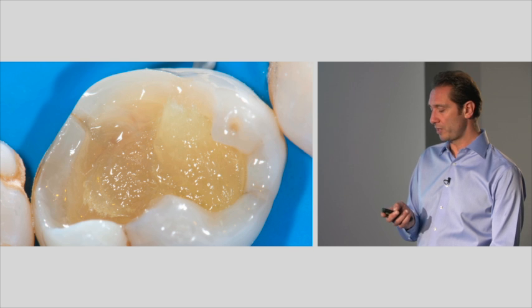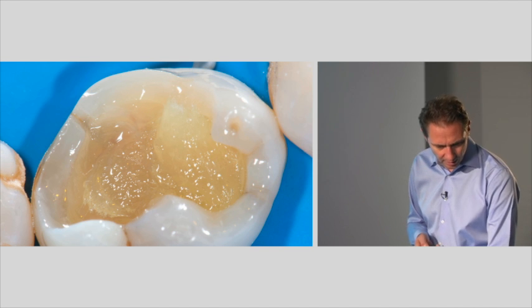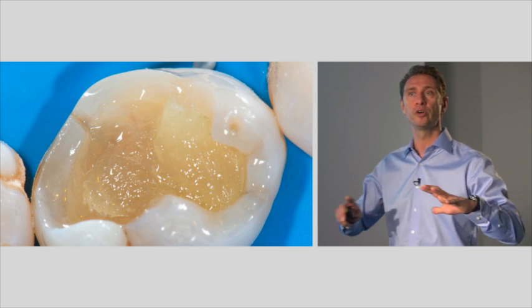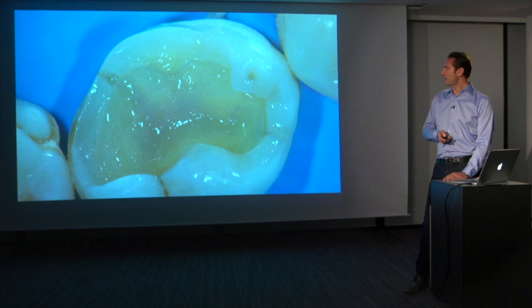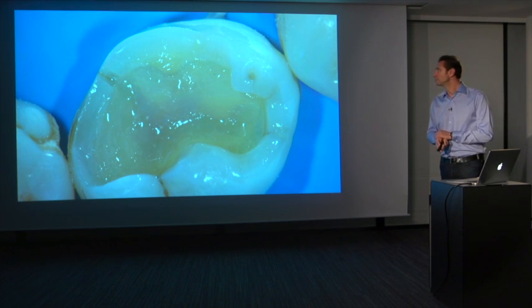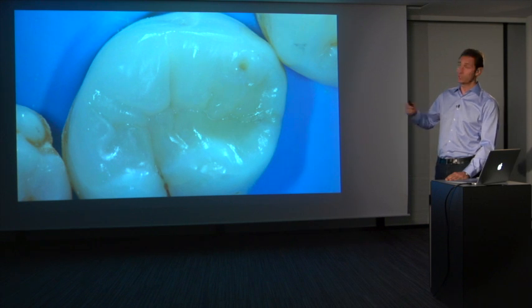and the fibers. So what you saw before was the first layer, this is the second layer. This material is just injected, and here you can see the fibers sticking out. Pushing on top, adapting it to the cavity floor will smooth the whole thing down. Fibers will be more longitudinal, and we will have a very nice surface to continue the build-up with. Finalizing the occlusal part and cuspal coverage, in this case again with G-aenial posterior.